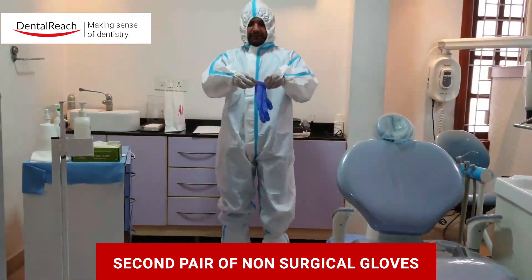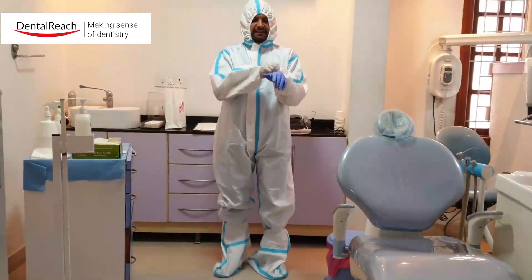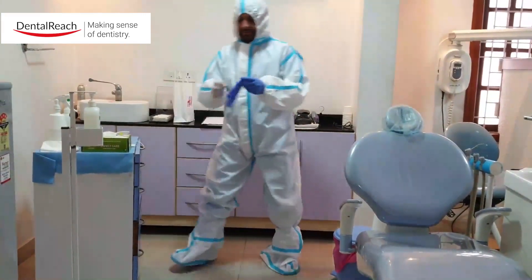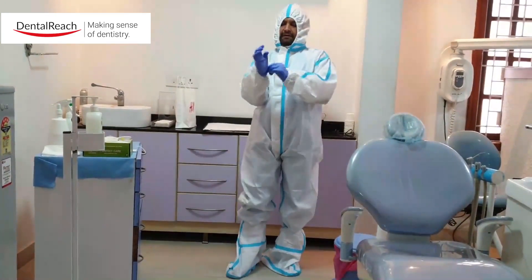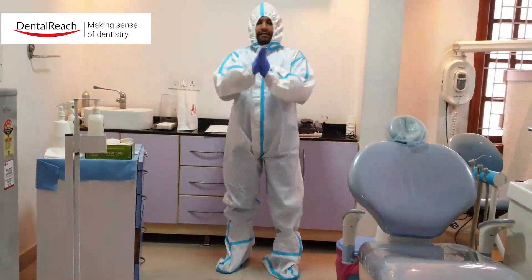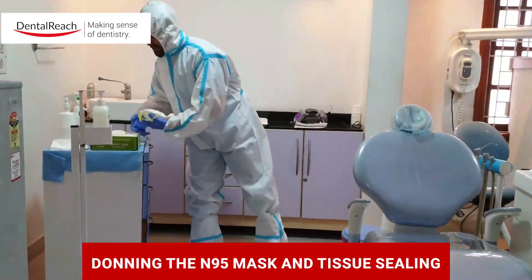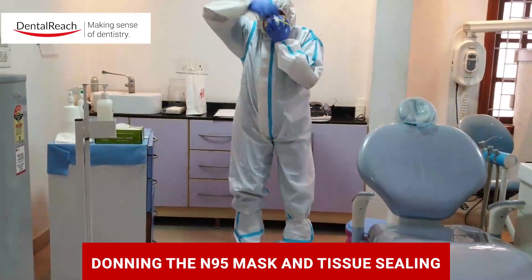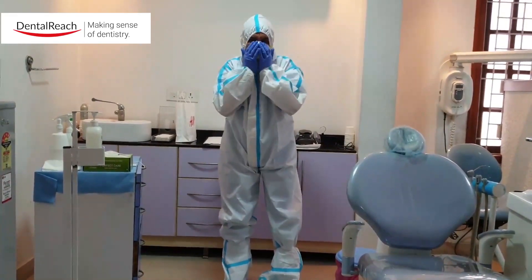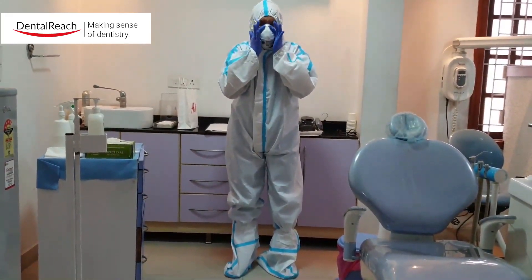Next we are going to don the N95 mask. Anything around the face area is a very sensitive area, so make sure that this is completely covered. At this point I sanitize myself again and rub my hands. Then we are going to don the N95. Just make sure that the tip is pressed and there is no leaking of any air around. Check a couple of times to make sure the fit is absolutely perfect.